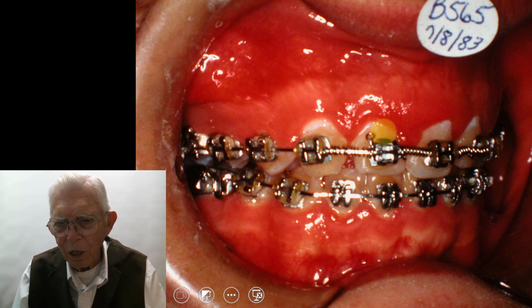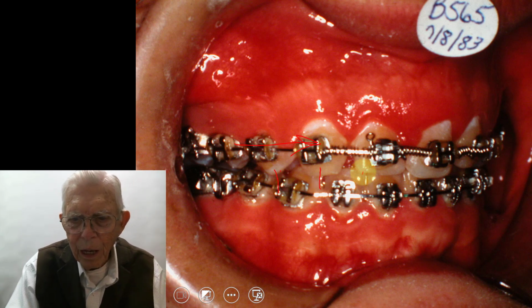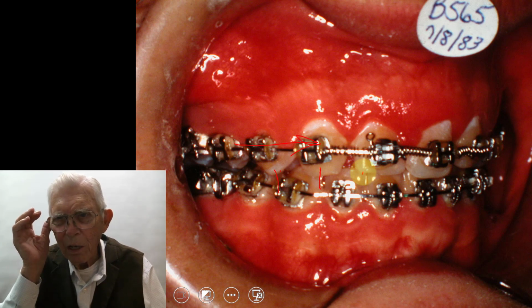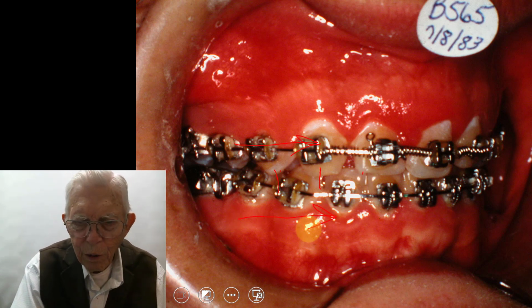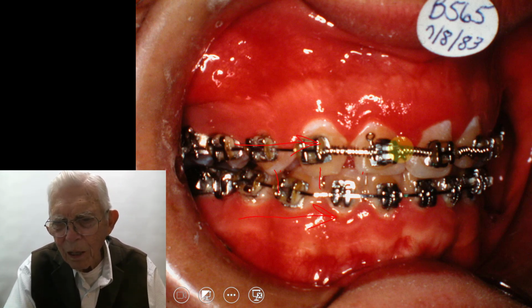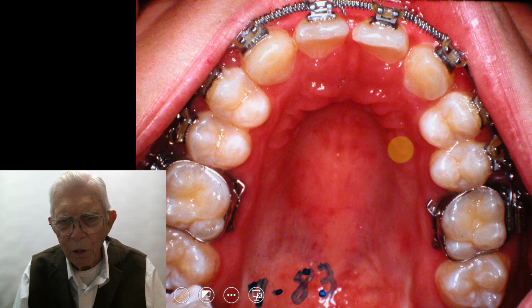We had these teeth in place and had moved the upper teeth up, but we didn't get them far enough up. And I think as he got this next three, let's see, it took from 83 to 91, and during that time, his lower jaw moved forward some on him, and that had to have a space in here. And so we'll show that to you.